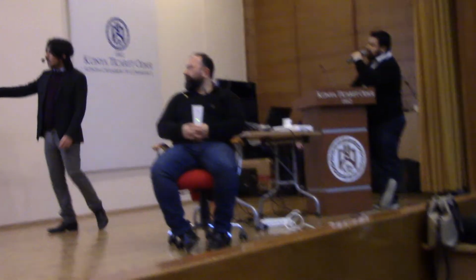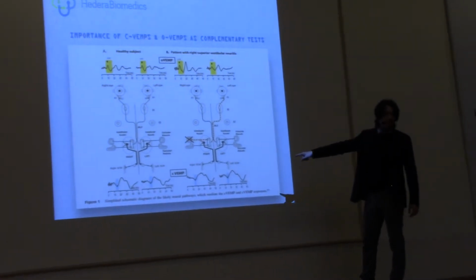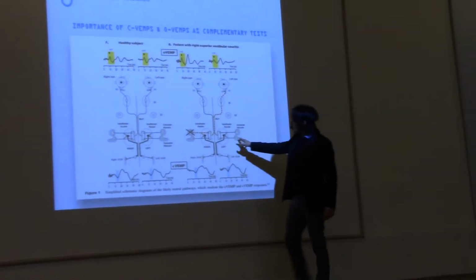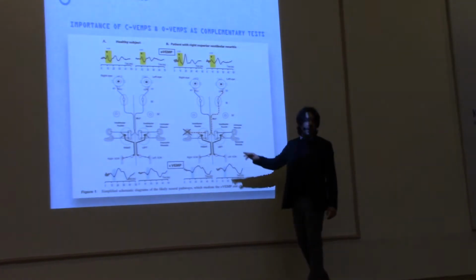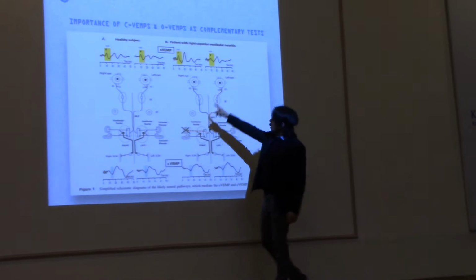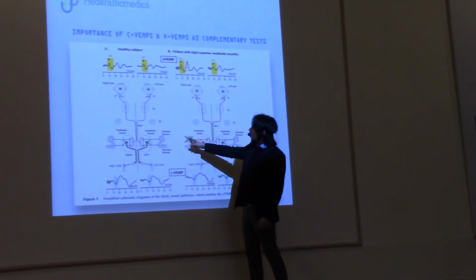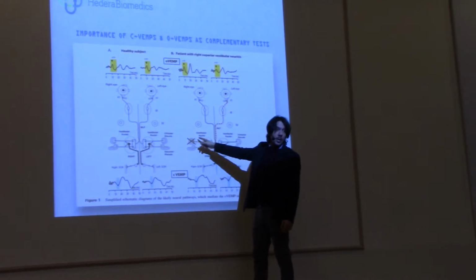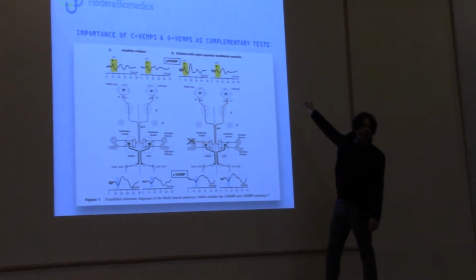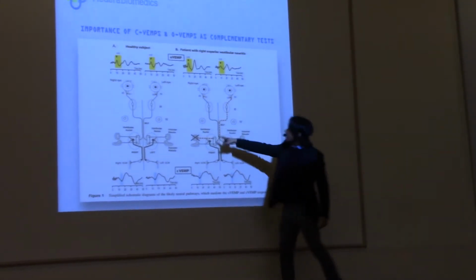Here on this pathological patient, you see that cervical VEMPs are normal. So our saccular macula, right and left, are okay. And utricular macula is reduced on the right ear, that is corresponding to the left eye. So crossed, the path is this.